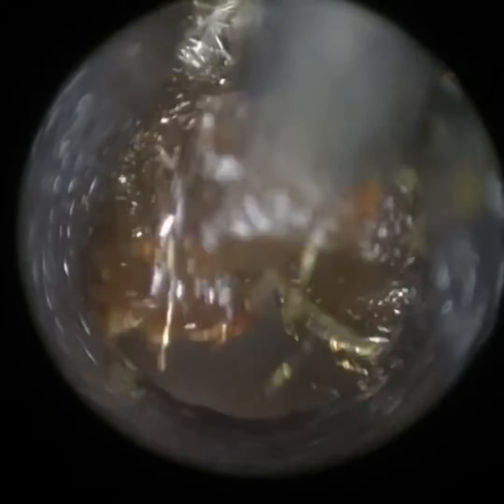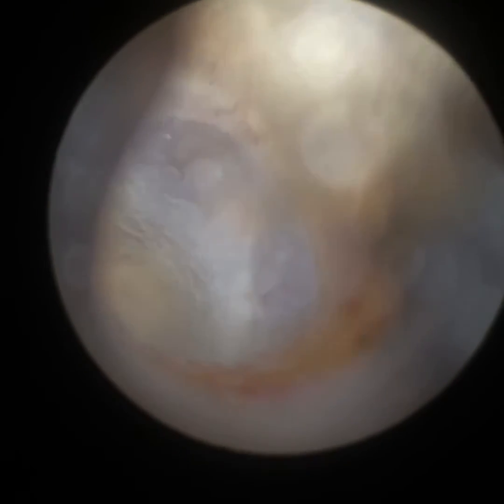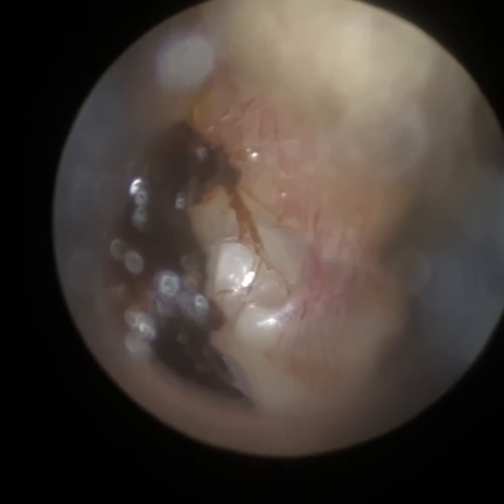The specialist then views inside the speculum using an ENT microscope or head loops, and with their dominant hand they hold the instrument and insert it through the speculum to make contact with the earwax in order to remove it. So that's the purpose of a speculum — it helps an audiologist or ear care specialist to stretch and widen the ear canal.